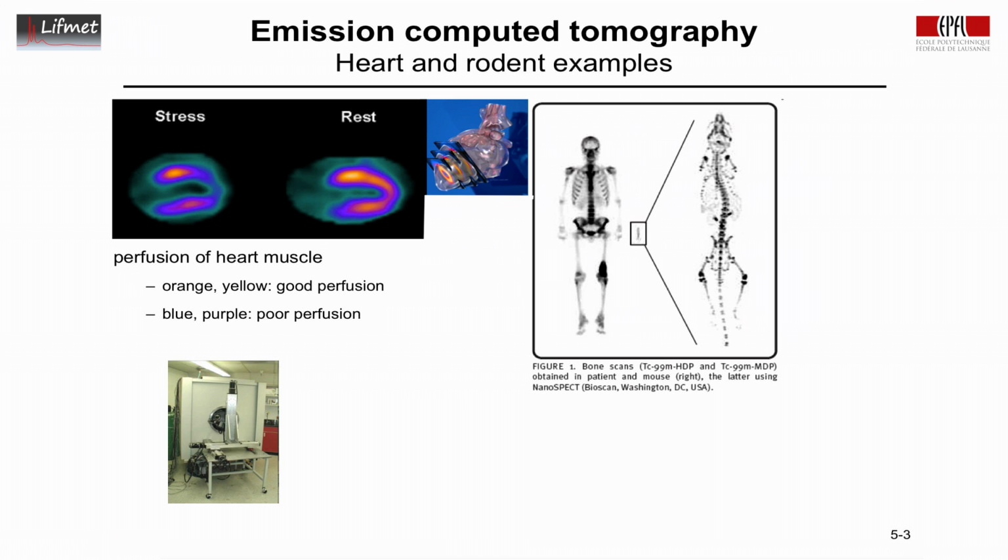And so if we look at a SPECT scanner for rodents, here we're looking at it. It's behind this box here, and we have here the opening. This is the patient bed now pulled up vertically. This would move the subject into the scanner here. So clearly this is a scanner where a human doesn't fit in there, but for the rodents, it is adapted to the size of the rodents, made smaller.